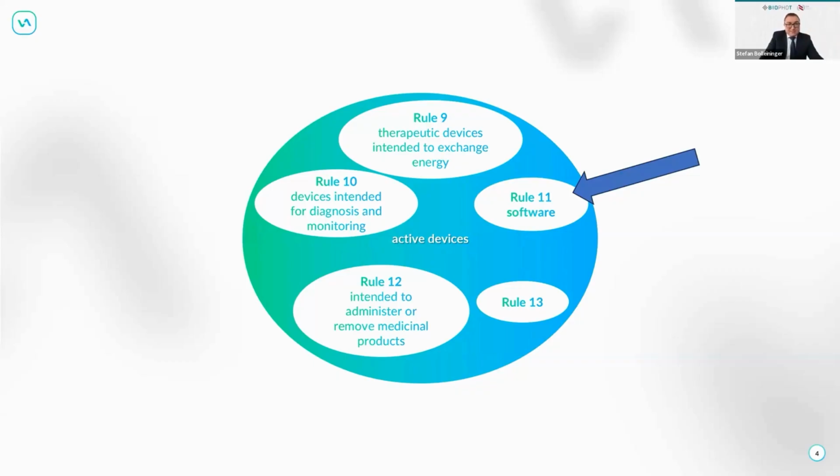Long story short, they are attempting now to change the rule to start always with class 1, so that your device is always a class 1 product unless it kills a patient, is in a severe situation, or in other medical situations, which then would lead to class 3, class 2B, or class 2A. It is right now a proposal, it's not yet done, so history will tell if the decision will be good and what will be the real outcome of that particular rule change.